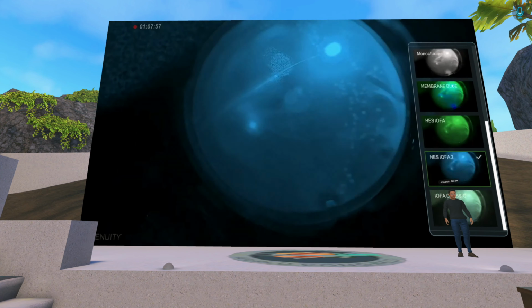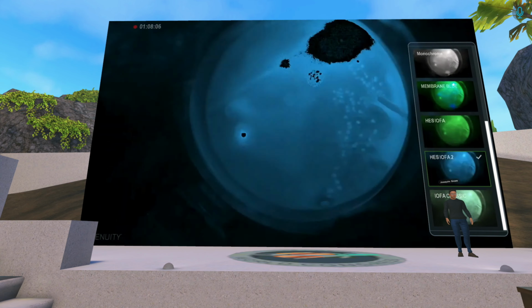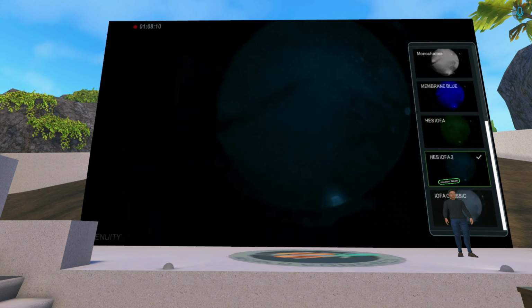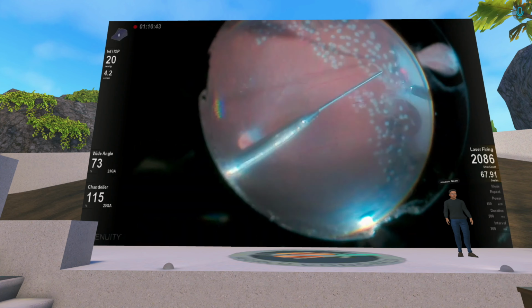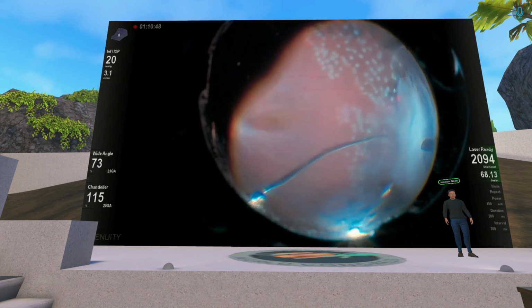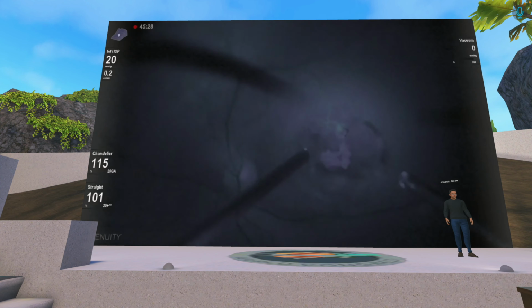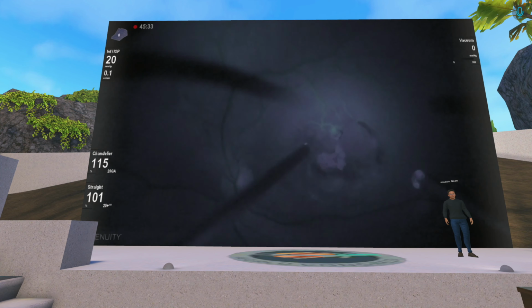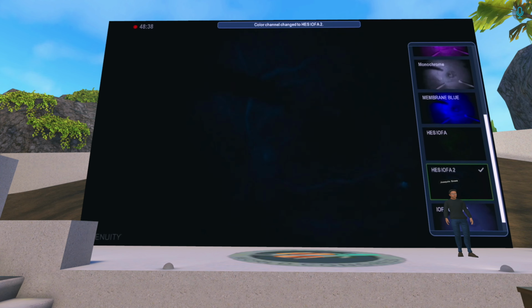And the other thing that's interesting is I think you see a little better through the vitreous hemorrhage with the fluorescein filter to some extent. Yeah. And here you can really see the ischemia well. So I think that's one of the big advantages of intraoperative FA, that we all talk about lasering ischemic retina and preserving non-ischemic retina.